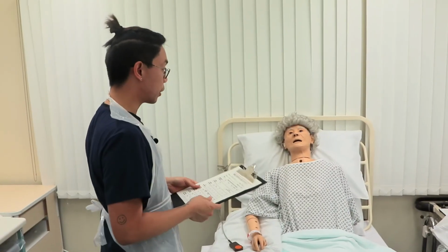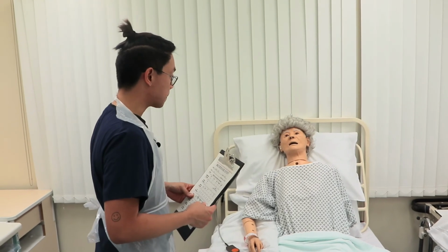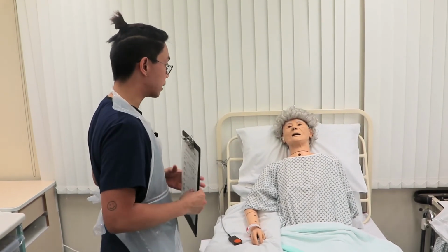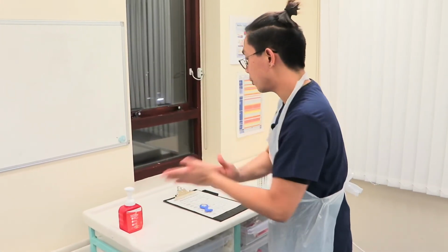Okay, so Catherine, have you got any questions for me? No, I'm good, thank you. Okay, I'm just going to do my aftercare. You've still got your call bell beside you. Press it if you need any assistance. Quick hand rub and don a new pair of gloves.